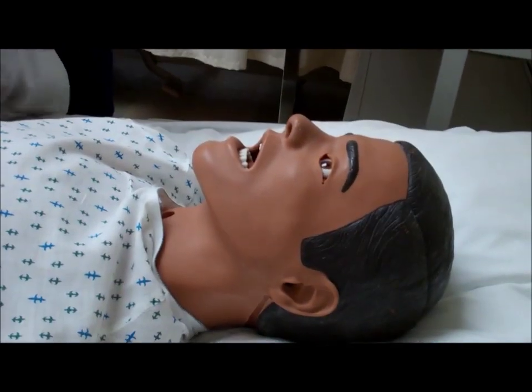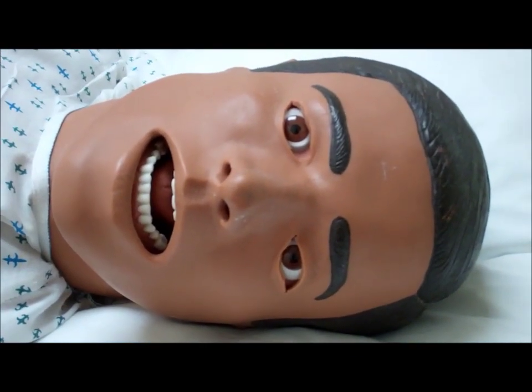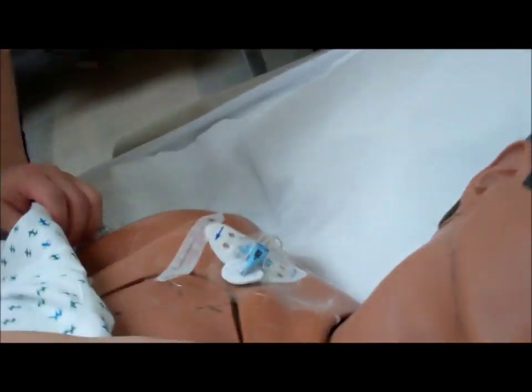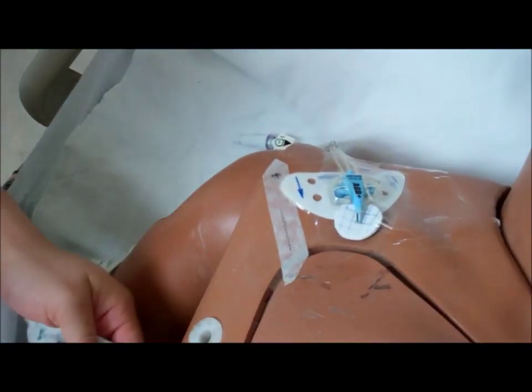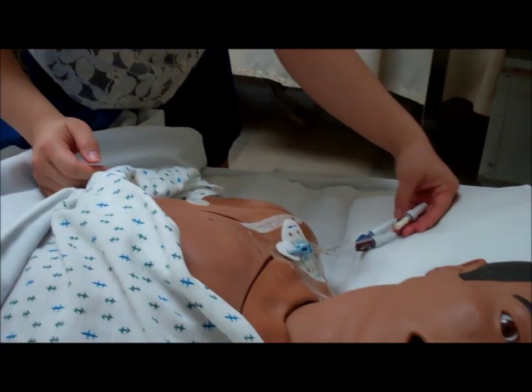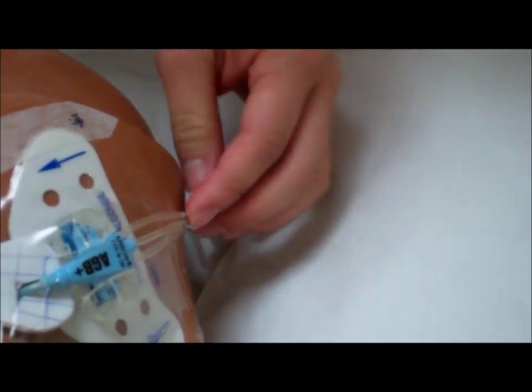So, I'm going to reposition the patient's head and turn this way and ask for his cooperation during this time. I've lowered the side rail to help me out, and I'm just going to expose the part of the patient's area that is needed. Make sure that I provide patient privacy also. And everything here is clamped, and these are actually the positive pressure ports, so we don't need the clamps for them. Okay?